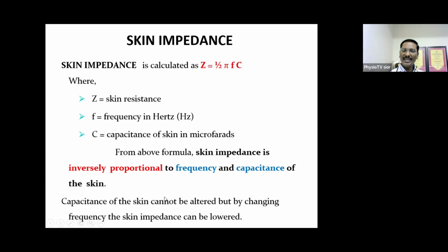However, the capacitance of the skin cannot be altered. But what we can alter is the frequency of the medium frequency current. The frequency of the current can be changed. If the frequency is increased, automatically the skin impedance is reduced.